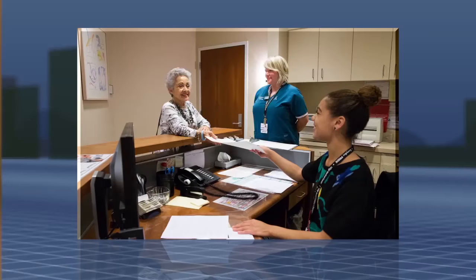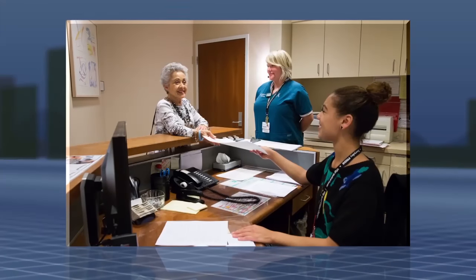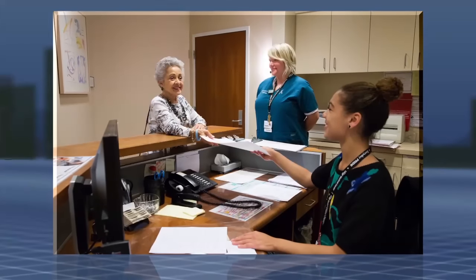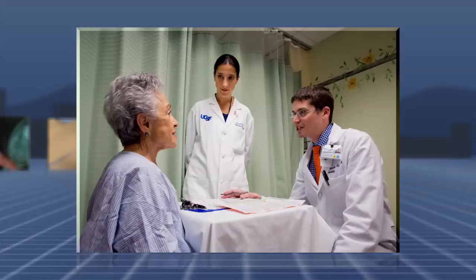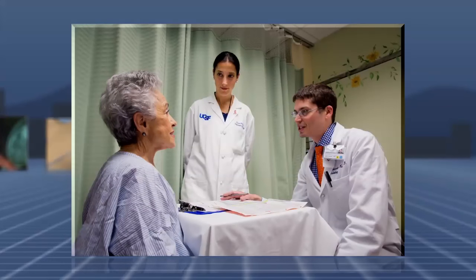Everyone you'll meet during your appointment is here to help your procedure go smoothly and to make you feel as comfortable as possible. Once you have checked in at reception and changed into a gown, you will meet your doctors who will be performing your biopsy: an attending physician who oversees the procedure, and a radiologist who is subspecializing in breast imaging.